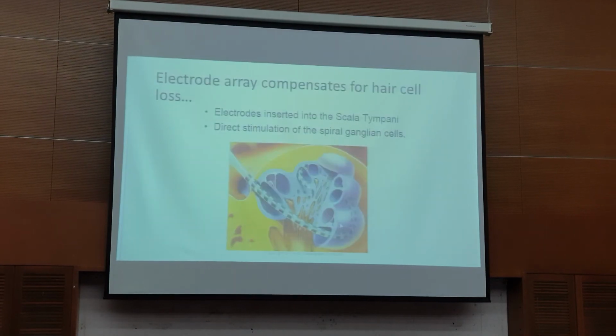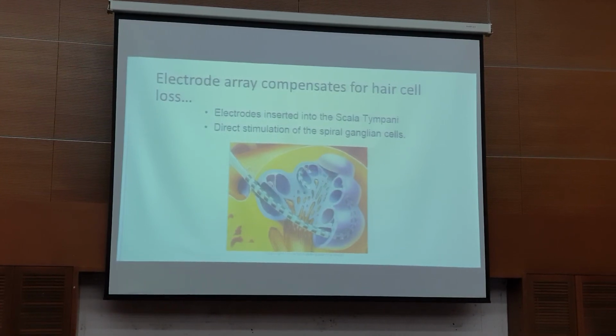Then that's when we suggest you fit with hearing aids and you do the validation and you see the results are not that good. So basically, for pediatric severe profound cases, I hope you all will be alert. From the very start, when it looks severe profound, alert them to the management option of cochlear implant, because it's difficult with hearing aids.